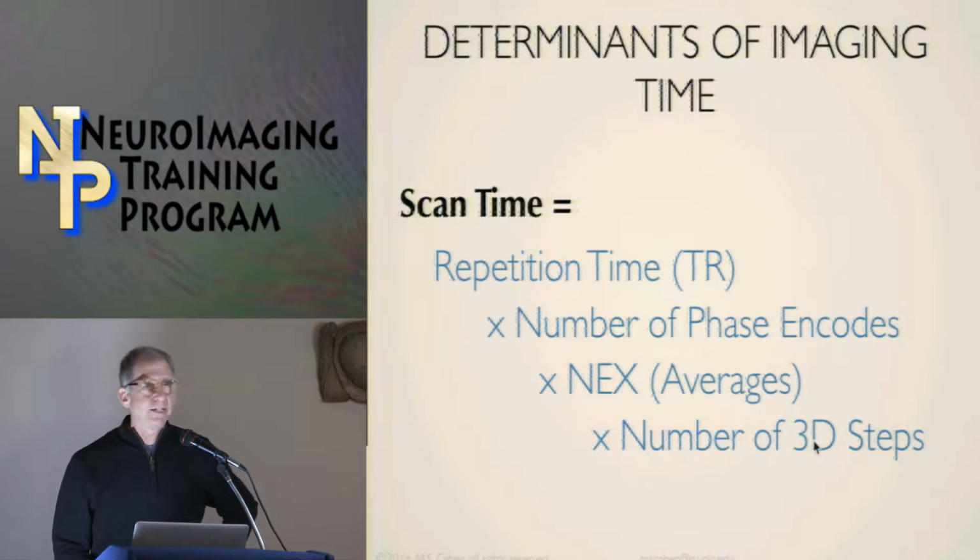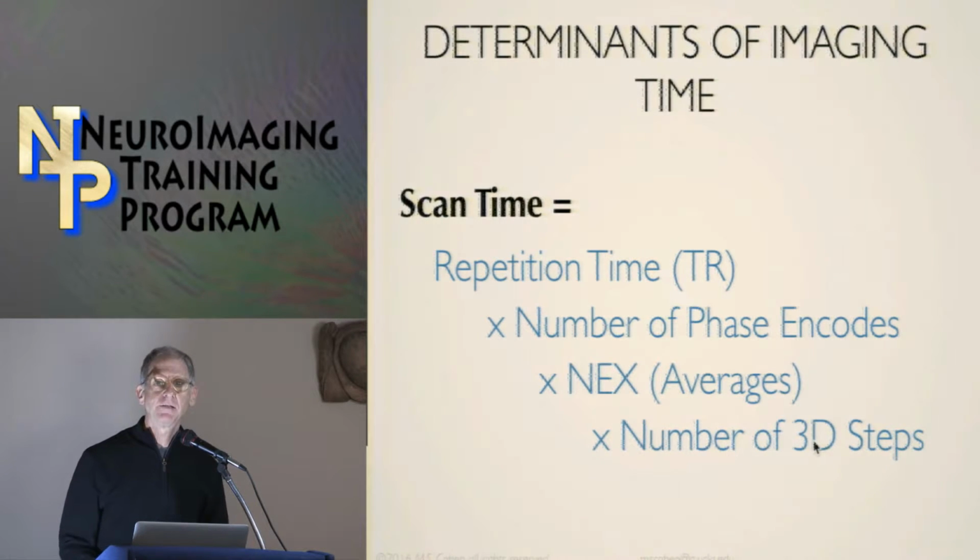People also do 3D encoding. All of you people using SPGR and MP-RAGE are doing 3D scans, which typically have hundreds of lines of data. And on the MP-RAGE scans, typically the TRs are kept to a few tens of milliseconds in order to make the scan times short enough. Actually, there are some other tricks with that.